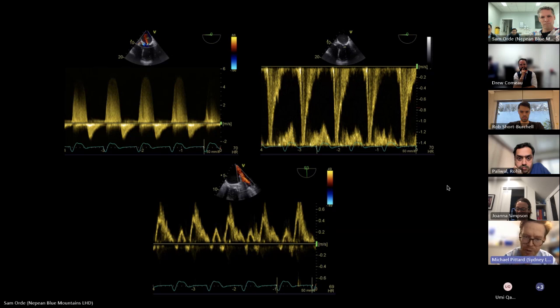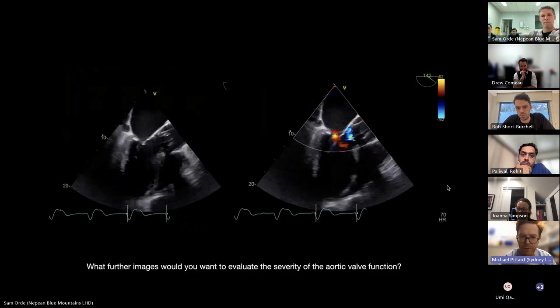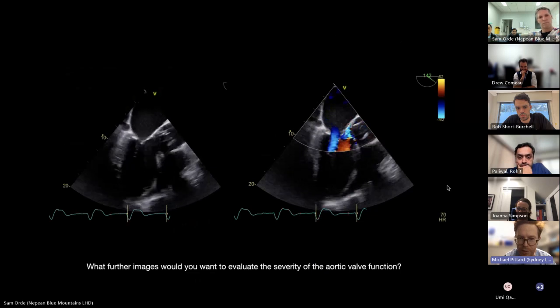But the pulse wave Doppler in the pulmonary vein, I can't see A waves. So I think that there is no reversal, but there's S wave blunting in the pulmonary veins. So these things kind of fit with moderate MR, but in terms of this patient who's hypotensive, that peak E wave velocity of 1.4 or even higher is quite concerning for a pretty significant MR contributing to the decompensation at this stage. I'm pretty worried about the forward flow through that bioprosthetic aortic valve too. Nice.